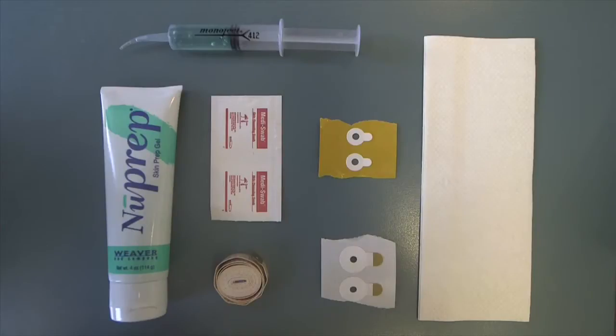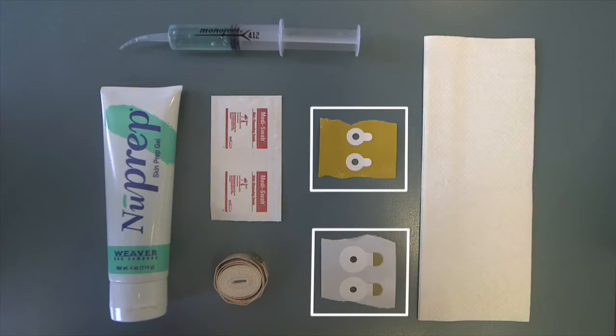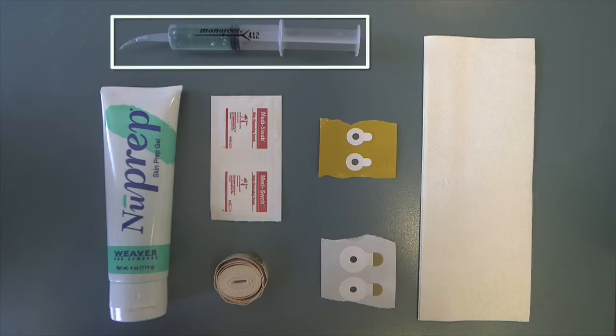In addition to the cap and the electrodes, you'll need a few extra things to set up the EEG system. For your setup, you will need the following: measuring tape, NuPrep exfoliating gel, paper towels, alcohol wipes, four adhesive rings, and a syringe filled with conductive gel.